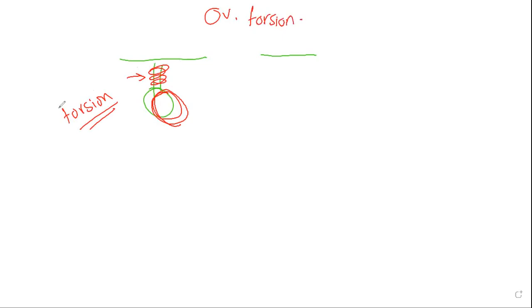Well, yeah. So if you see some of the signs here, we're going to discuss, without a cyst in the ovary, do not be very astonished. Yeah, it can happen. But when the ovary itself has a long pedicle, look at this, when it has a long pedicle, what happens?